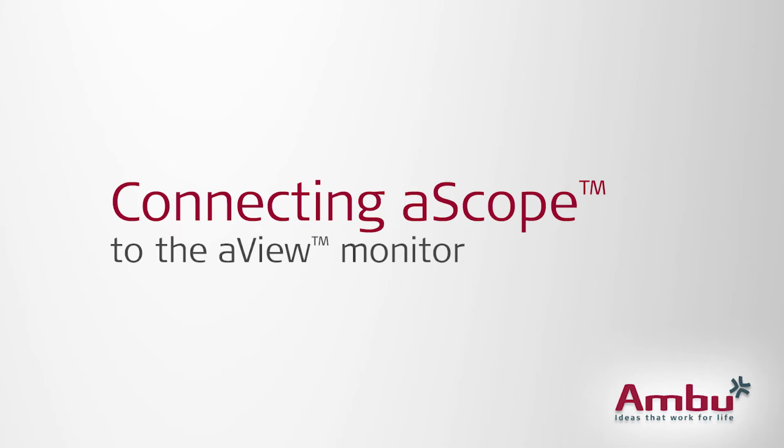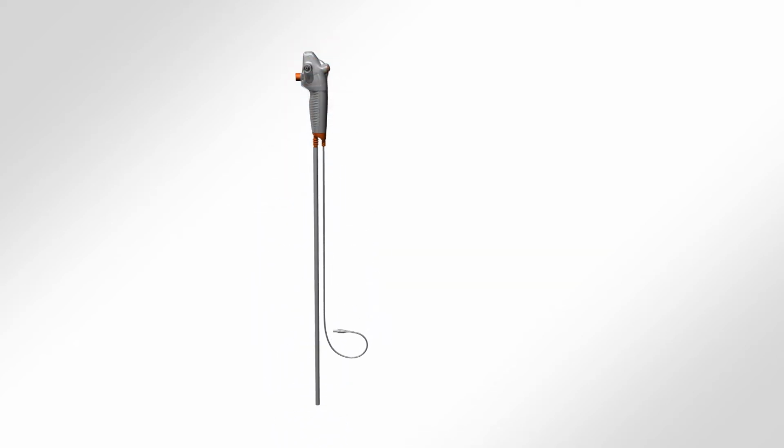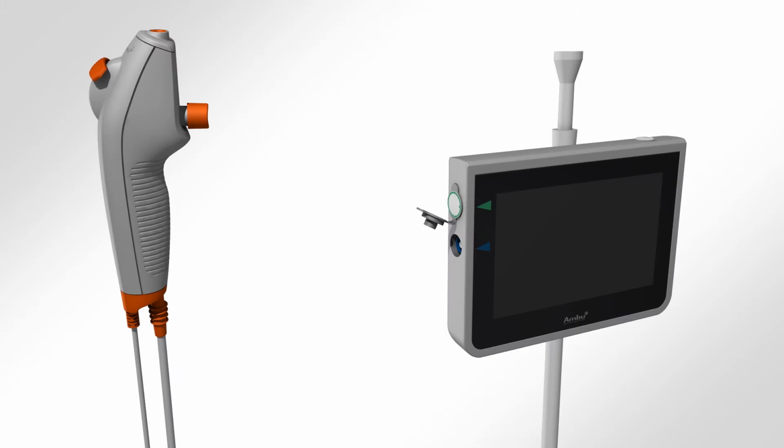Before using the aScope, first visually inspect the pouch to make sure the seal is intact. Open the pouch carefully and remove protective elements from the handle and insertion cord. Check to make sure there are no rough surfaces or sharp edges which may cause harm to the patient.